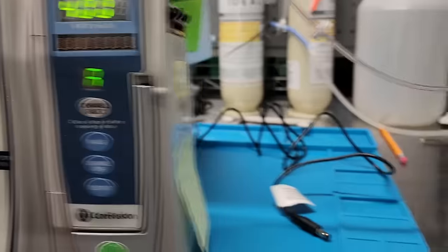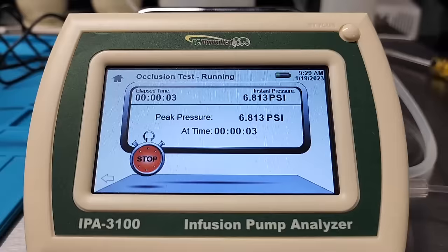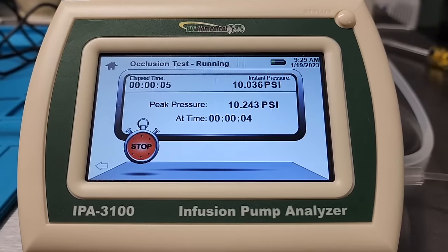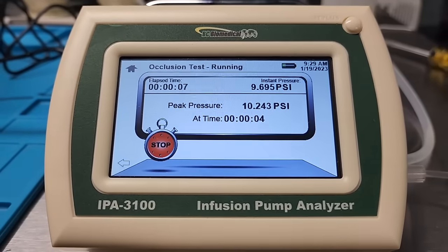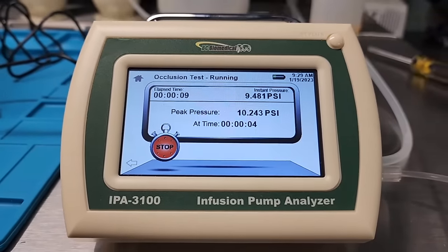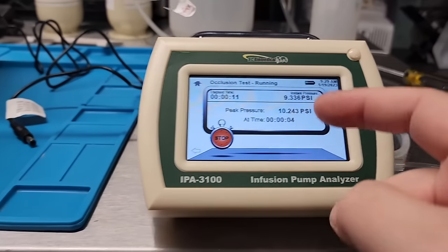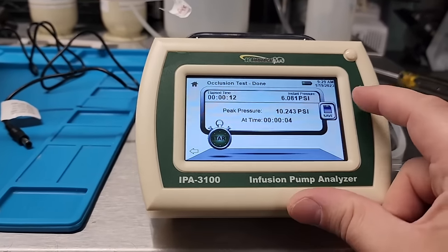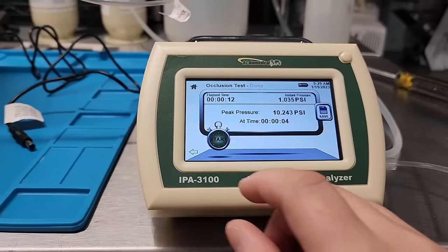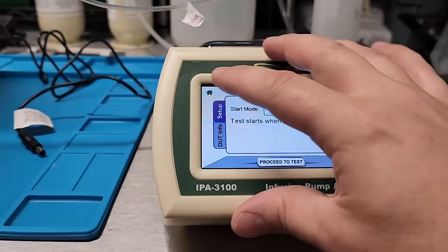Okay, here it goes. It's clicking down. Our pressure is building quite quickly. There we go. 10.2 was the pressure that it ran at. I'm going to stop it. So it's going to save that result to our record. Pretty cool.